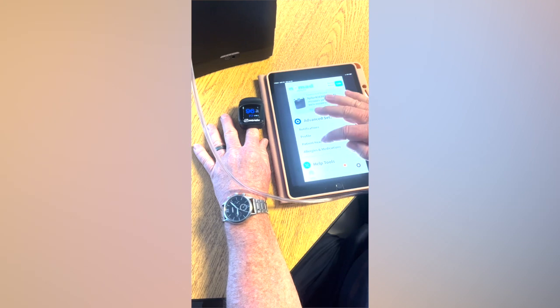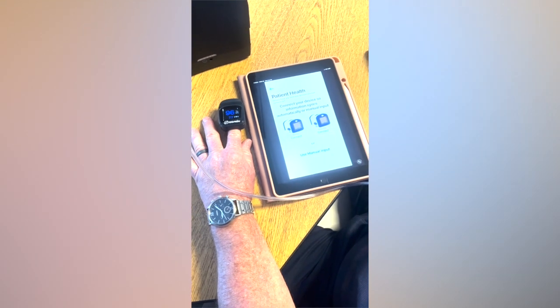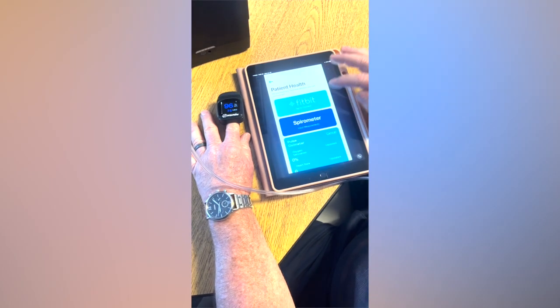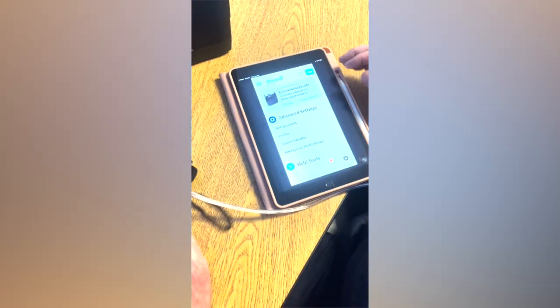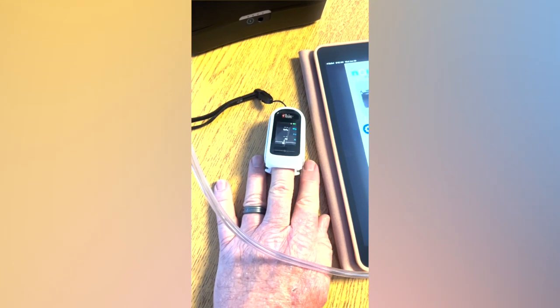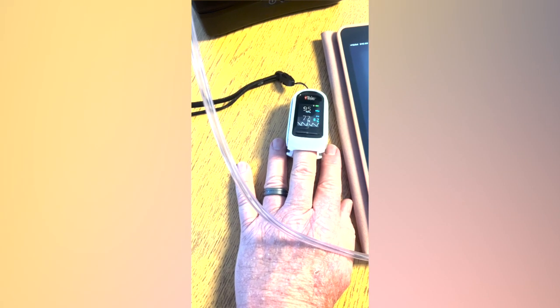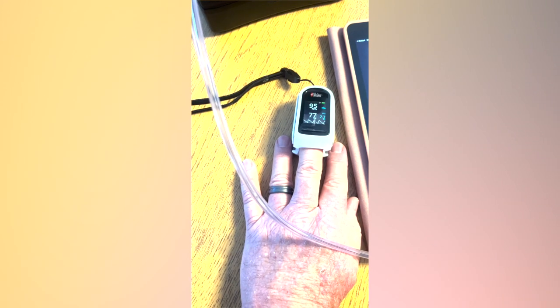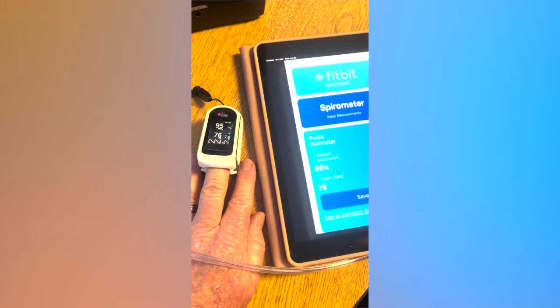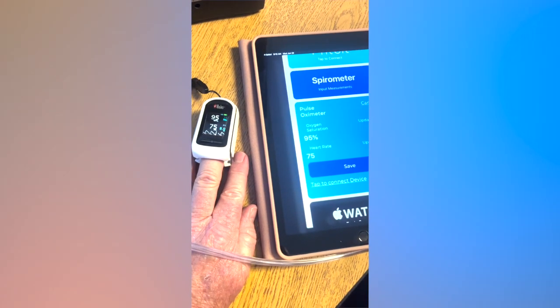Here we have a second pulse oximeter, the Masimo device, and you can see the information being provided on the patient. The app is similar to the other device we just connected. It simply connects, and here we go. You can see that it's matching up the data from the oximeter on the fingers. It matched up on the app, and this allows the information to be stored, and a patient will then have the record of this information all in one spot, because now you've got the Fitbit information. If they have an iWatch, you have that information. You'll have Samsung and Android and other abilities to connect on various devices.